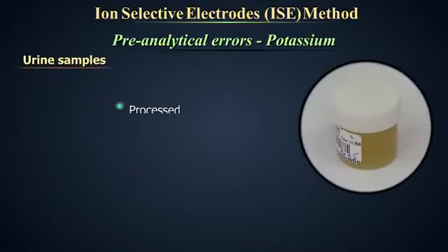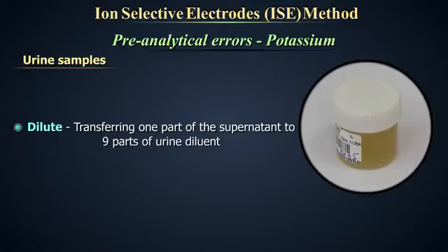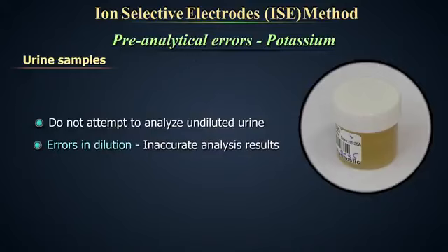Urine samples can also be processed. Refrigerate urine specimens until time of analysis. Centrifuge urine specimens to remove cellular matter, crystals, etc. Dilute the urine specimen by transferring 1 part of the supernatant to 9 parts of urine diluent. Urine must be diluted. Do not attempt to analyze undiluted urine samples. Errors in dilution will cause inaccurate analysis results.